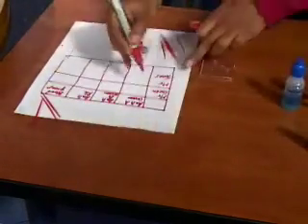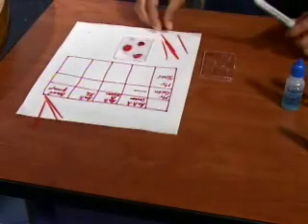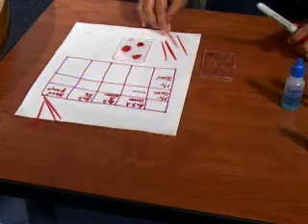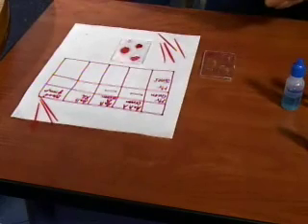So I put a negative. That means there was no agglutination. In the second one, where I put the anti-B serum, again I see that there is no agglutination. So that means there was no B antigen. So I put a dash there too.